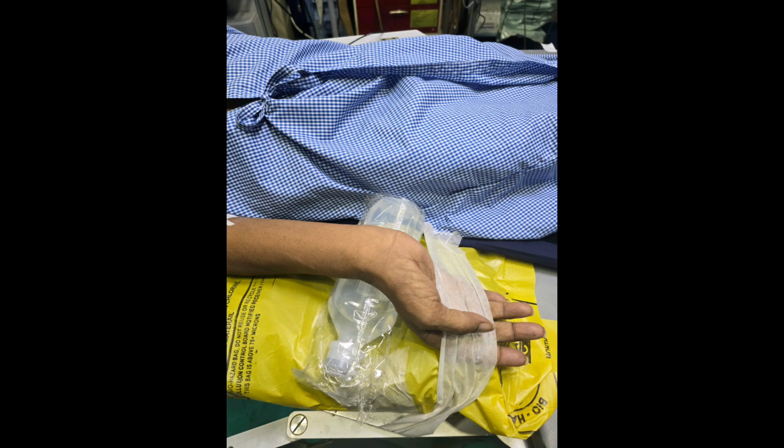Today I'll show how I puncture the radial artery. I have good success with this technique. Hope it helps others also.